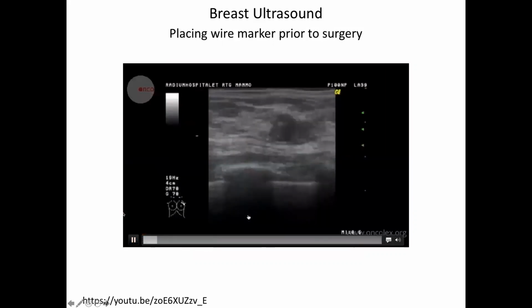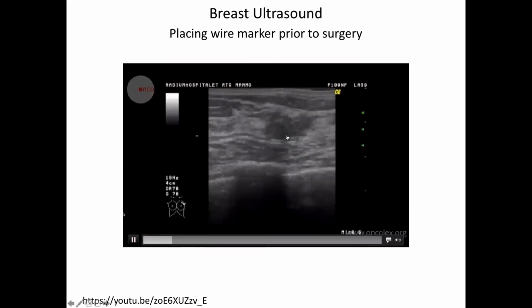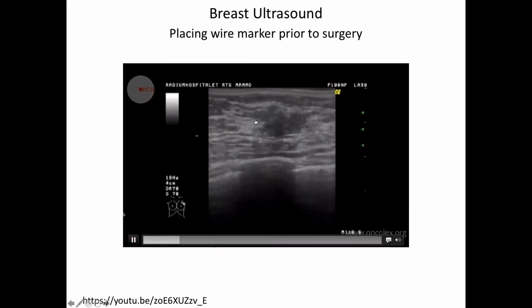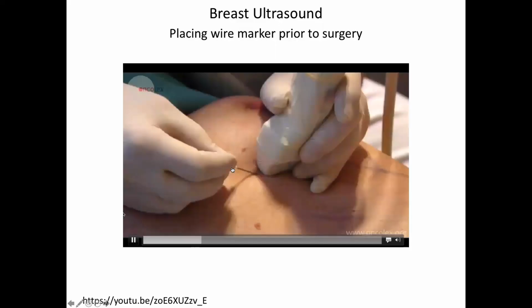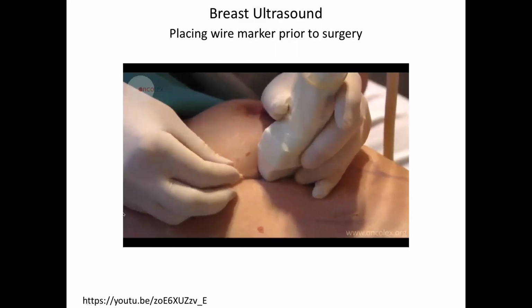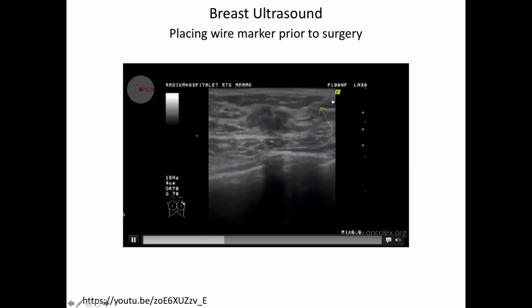Yeah, okay, so this is what she's looking at on the screen, right? Tumor comes into view here. And you look how dynamic stuff is underneath, right? And so small changes in the scan plane will change what's going on here. Okay, in this case, she is inserting this needle and she's watching that.